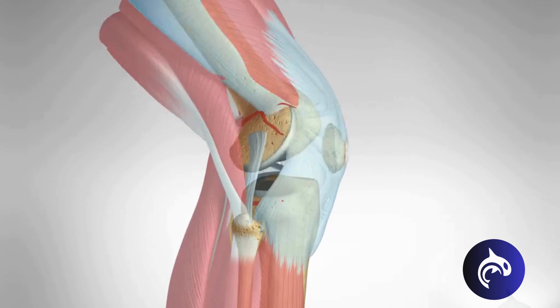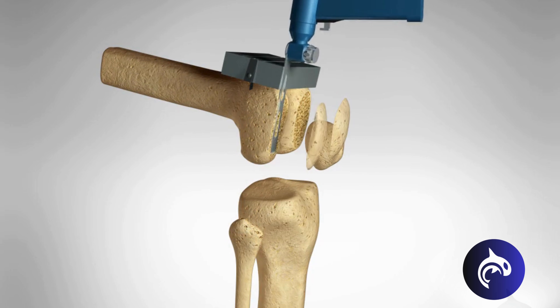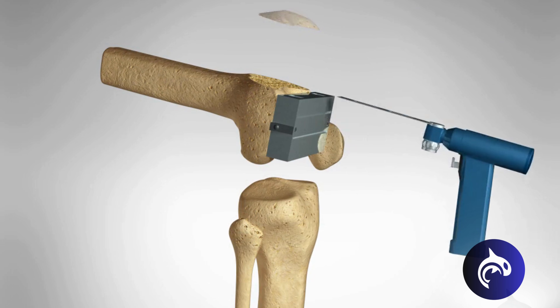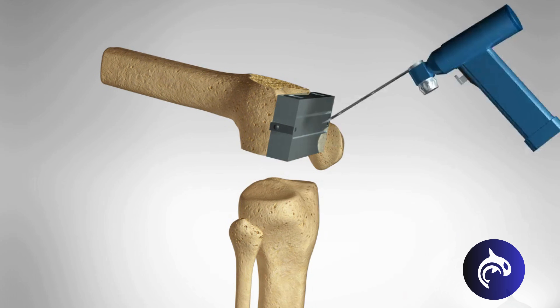First, the doctor will use a series of guides to prepare the femur. Damaged cartilage surfaces will be removed along with a small amount of underlying bone. This will ensure proper implant size and alignment of the joint.